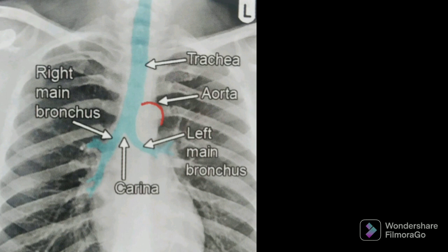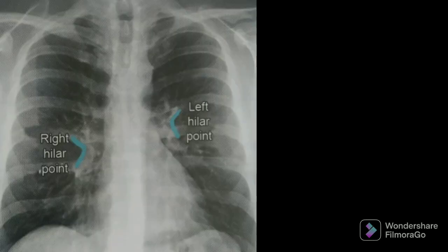We can also comment on the outline of the aorta. Here we see the hilum, which is wedge-shaped. An important point is that the hilum is where certain lung structures leave the lung — including bronchi, pulmonary veins, and arteries. One more important point is that the left hilar point is always higher than the right hilar point.